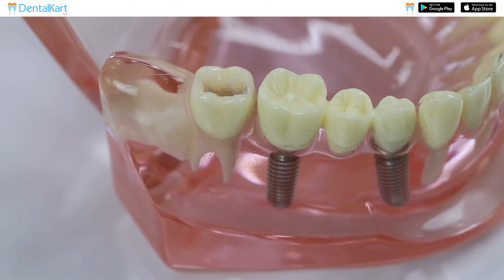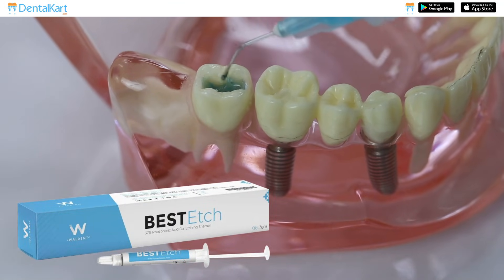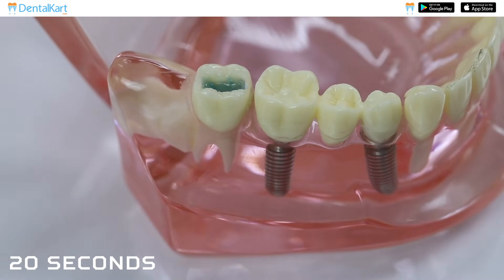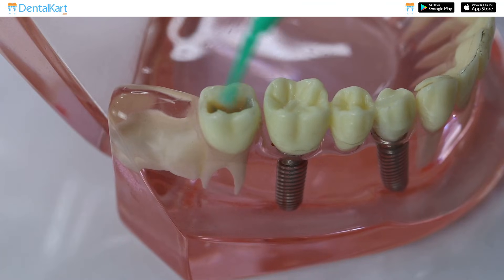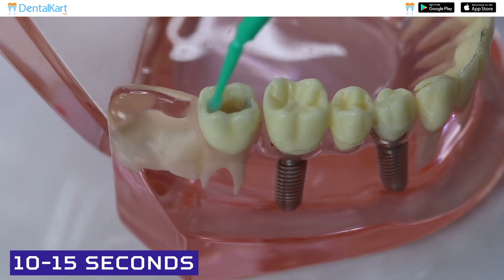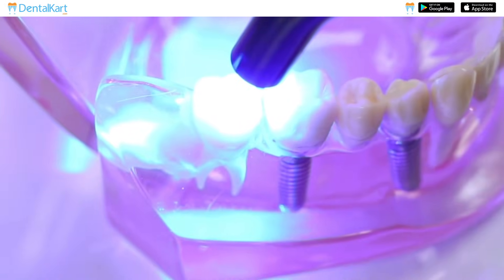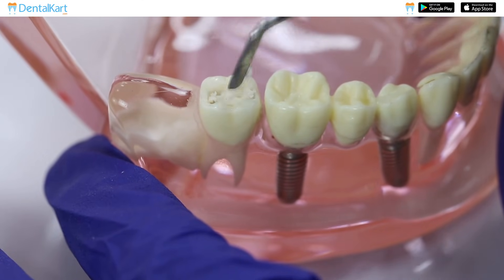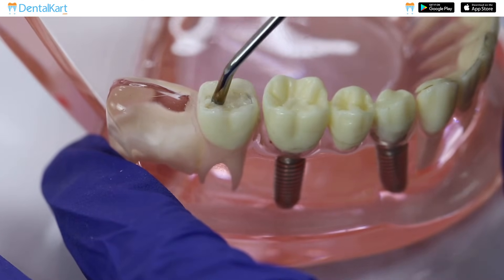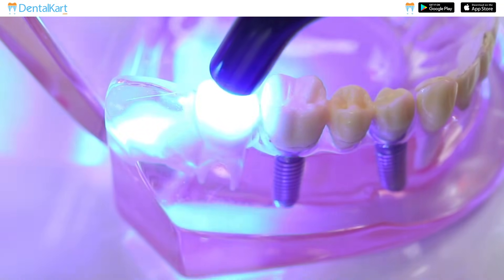Prepare the cavity and dry the surface. Etch the tooth surface with Walden Best H, 37% phosphoric acid, for 20 seconds. Wash thoroughly and dry it completely with a 3-way syringe. With the help of an applicating tip, apply Nanobond on the prepared surface. Gently blow away excess bonding agent with a 3-way syringe. Light cure the Nanobond for 20 seconds. Now place Walden Nanofill Zirconium Composite in increments of 2 mm or less, and cure each increment for 20 seconds.